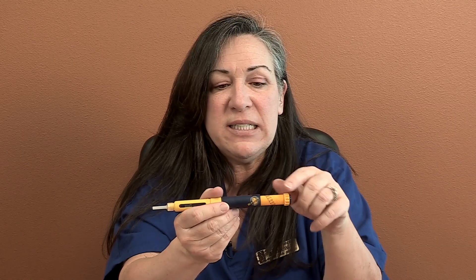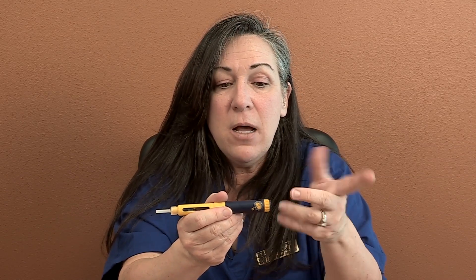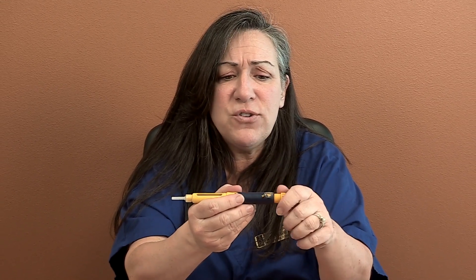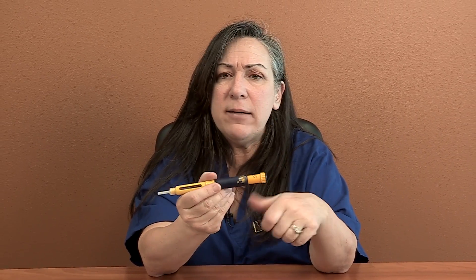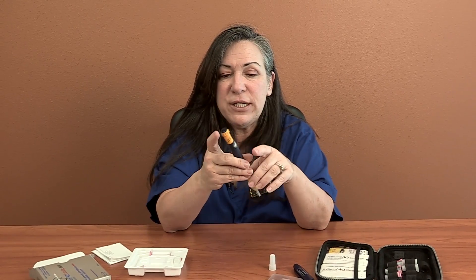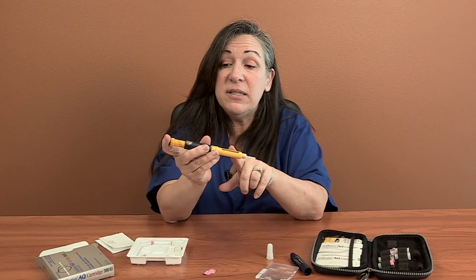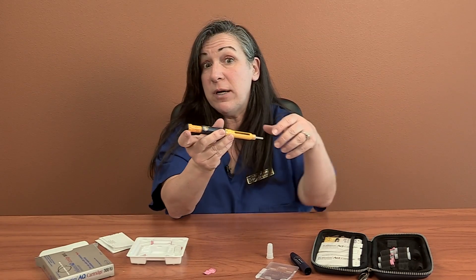In order to release this, if I were to twist it too far, I could just keep going to the end and it releases so I could take it back to zero. Basically, you just dial up — and let's say our dose was 300, I would just dial it right up to 300. Now this is a syringe with needle and everything ready to go; this becomes a little plunger. I'm not actually going to do it — I don't want to waste the medicine — but this will just compress, click click click click, and I'll do a little shot in my tummy or in my leg.